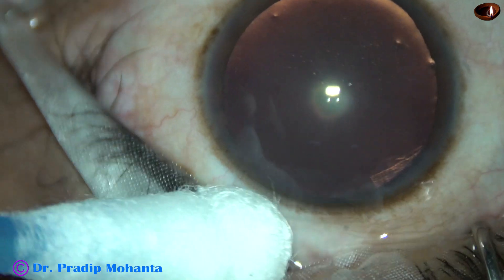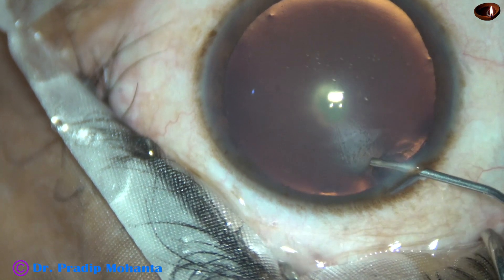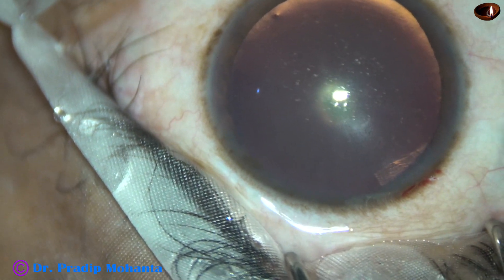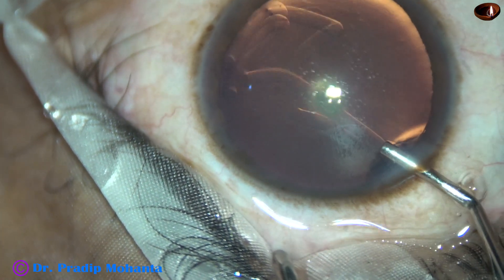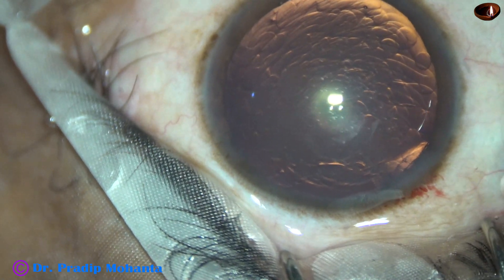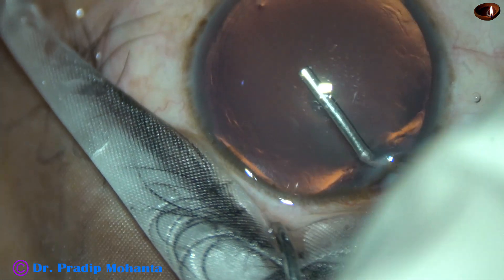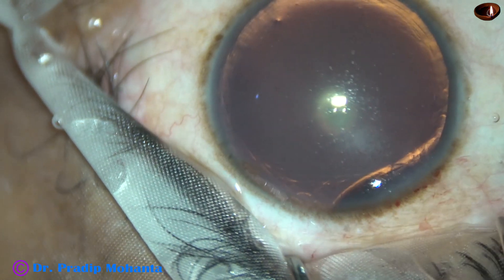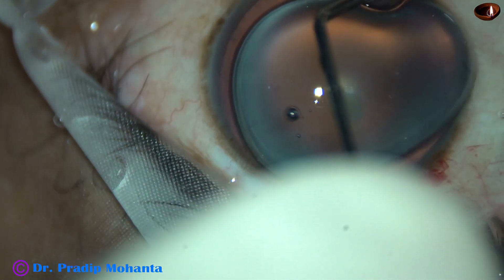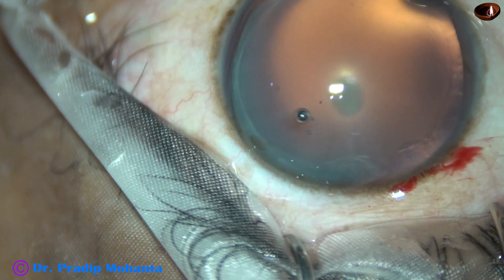It is recommended that in posterior polar cataracts, or whenever you suspect a cataract to be a posterior polar cataract, you should not do hydrodissection. But Dr. M. S. Ravindra of Karthik Netralaya, Bangalore, India is a strong proponent of doing hydrodissection in cases with posterior polar cataract, keeping the intraocular pressure on the lower side.